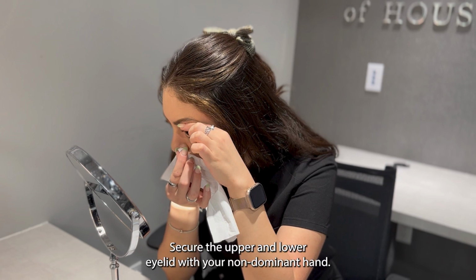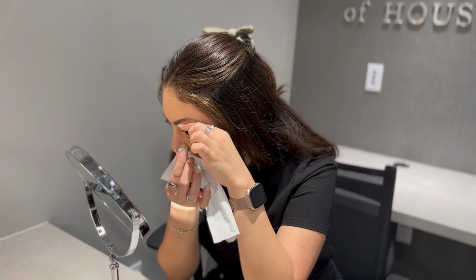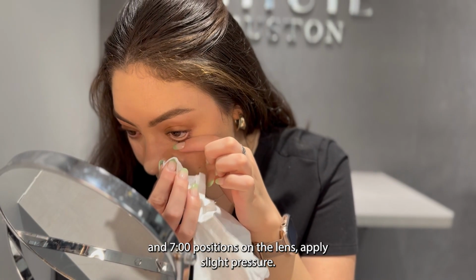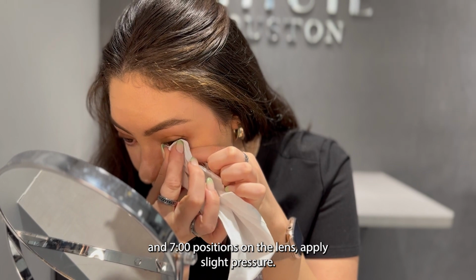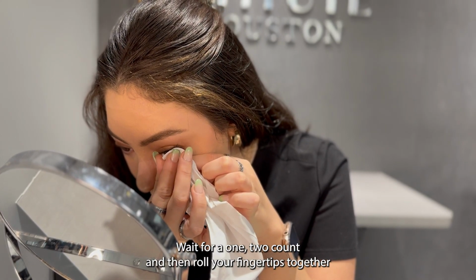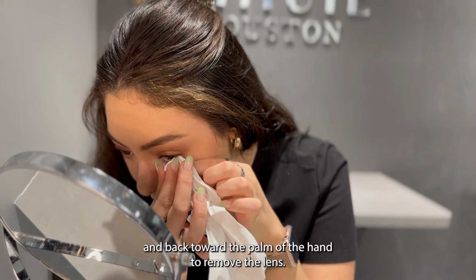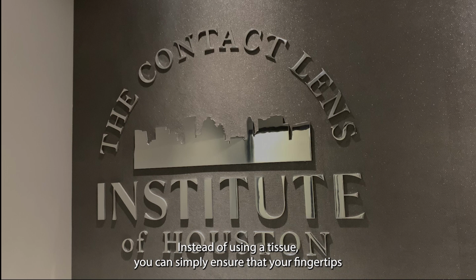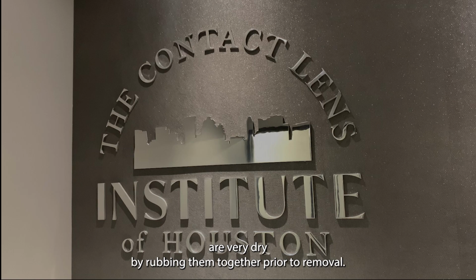Secure the upper and lower eyelid with your non-dominant hand. Using a narrow pinch with the fingertips at the 5 and 7 o'clock positions on the lens, apply slight pressure. Wait for a 1-2 count and then roll your fingertips together and back toward the palm of the hand to remove the lens. Instead of using a tissue, you can simply ensure that your fingertips are very dry by rubbing them together prior to removal.